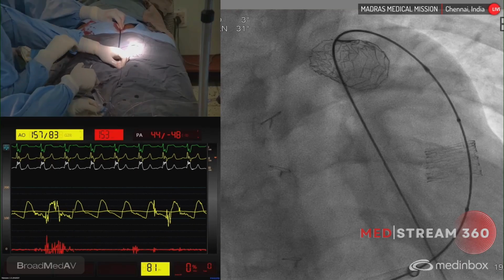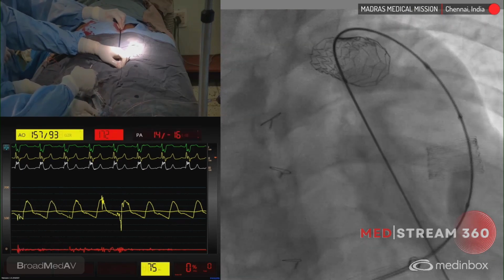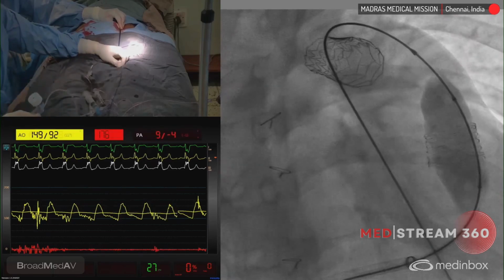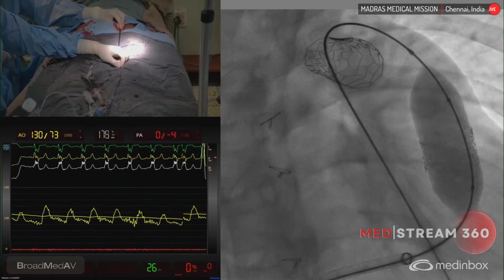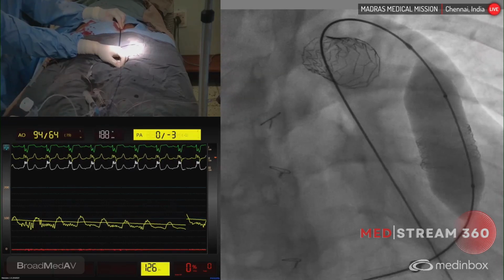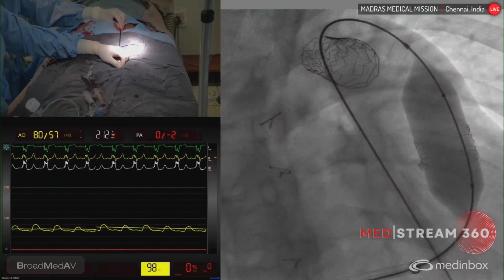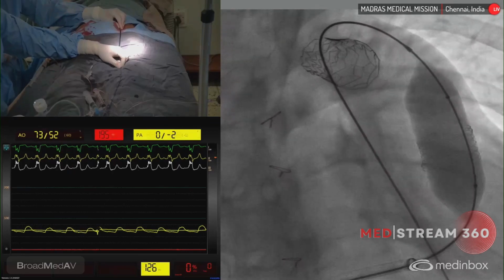Right now, as I'm inflating the balloon, Uday, the patient may get into hypotension. Okay, yeah, keep inflating. I'm inflating to 2, 4, 6, 8, 10. I'm finding that it is significantly shorter. 12, 13, 14. Okay, 14. Little bit more. Yeah, 14. Okay. Now we can deflate.